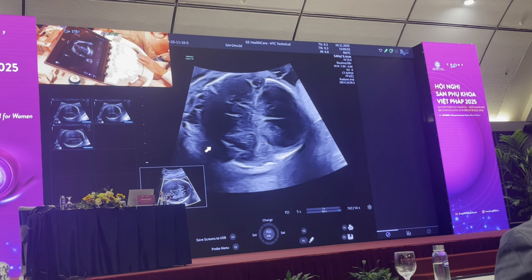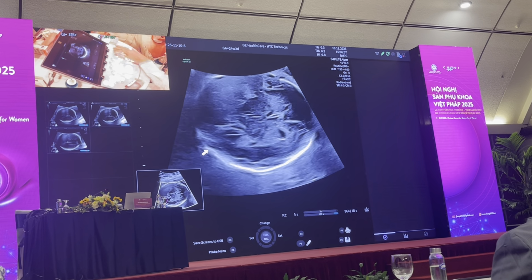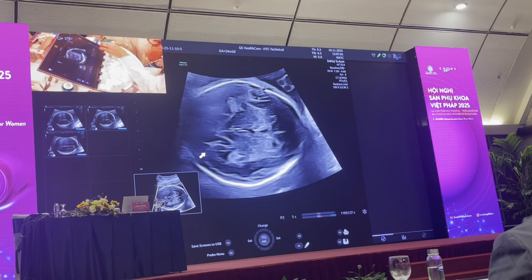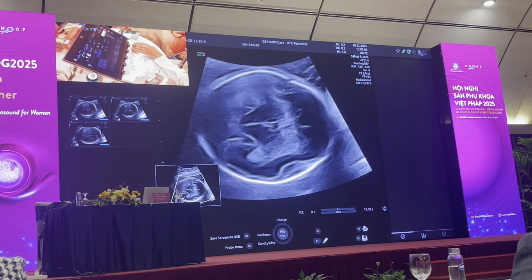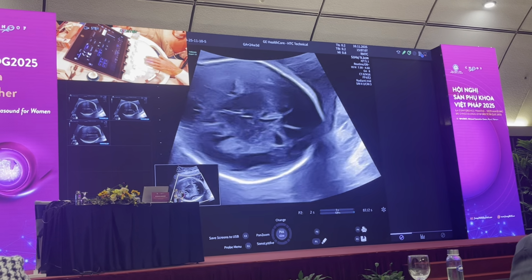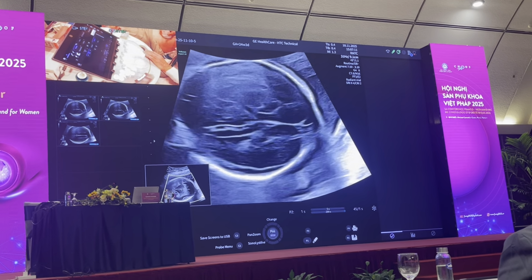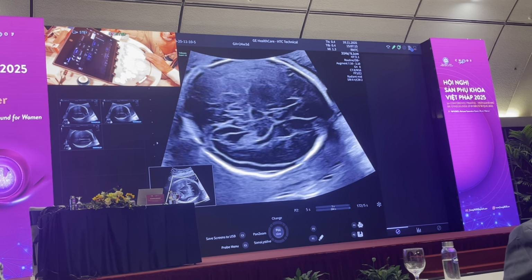At the level of the cerebral lateral ventricle, I want to measure, because this is the next section down, the size of the cerebral lateral ventricle. So I take down my magnification, and I bring the walls of the lateral ventricles into view. For this, I'm going to augment to get a little bit more penetration. And when I get the walls of the lateral ventricles into view, I need to bring my CSP in at the same level.